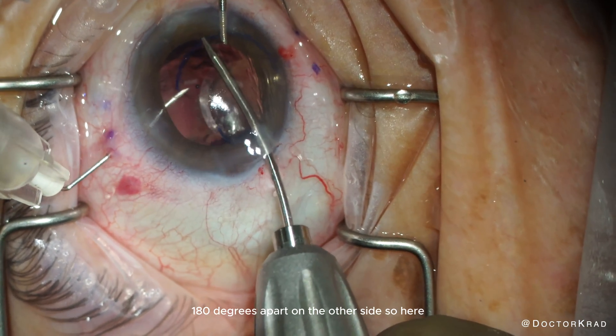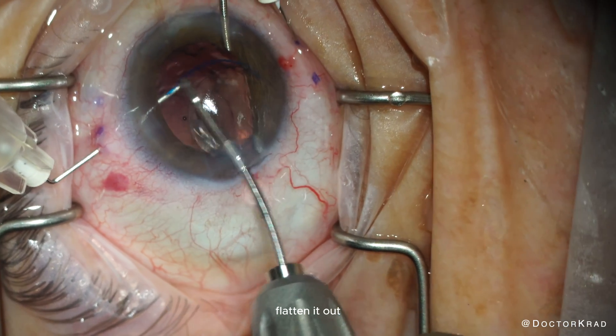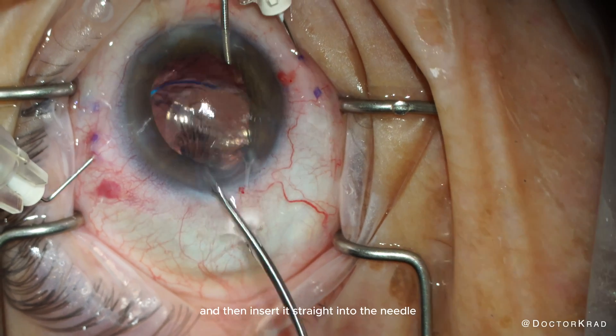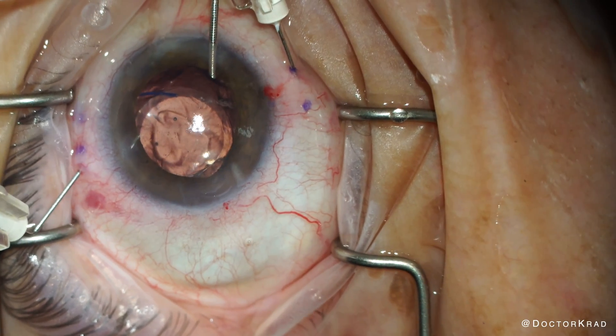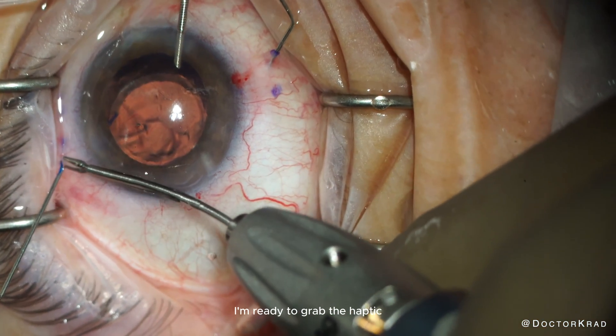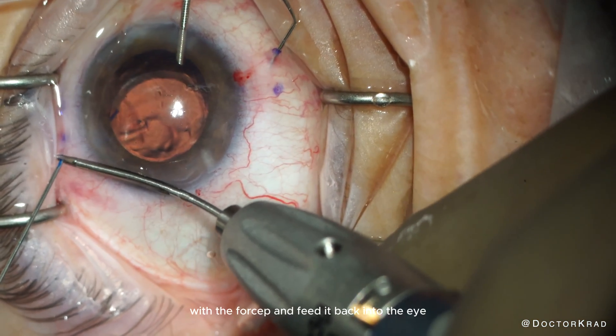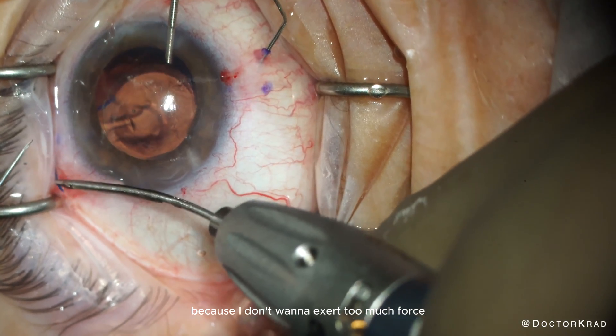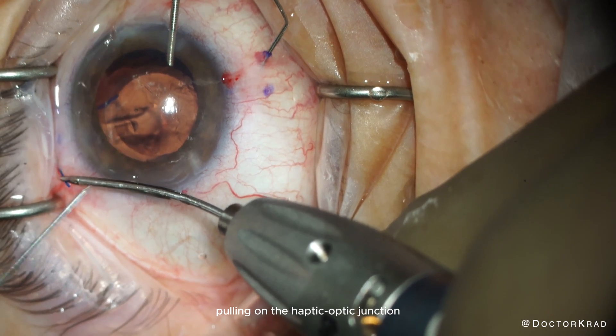Here I rest the tip of the haptic on the bevel of the needle, flatten it out, and then insert it straight into the needle. It goes in fairly easily. As I withdraw the needle, I'm ready to grab the haptic with the forceps and feed it back into the eye, because I don't want to exert too much force pulling on the haptic-optic junction.